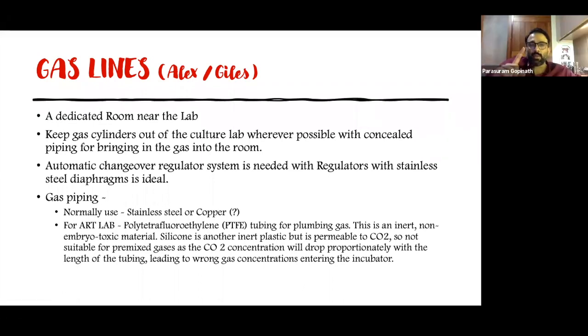Thank you. One thing I wanted to ask is, unlike abroad, when it's a separate room, the lines to the embryology lab have to come through walls. And what we have in India are not hollow walls where we can pass these tubes. So in that kind of scenario, we might not be able to use these silicone or other flexible tubes. At that point, do you suggest some other way of passing these tubes? Alex, how do you generally do it in clinics in India?